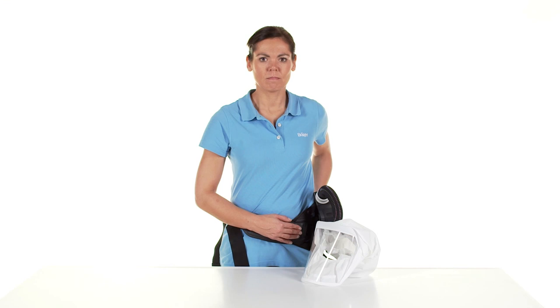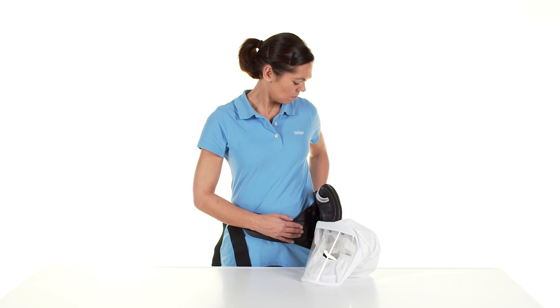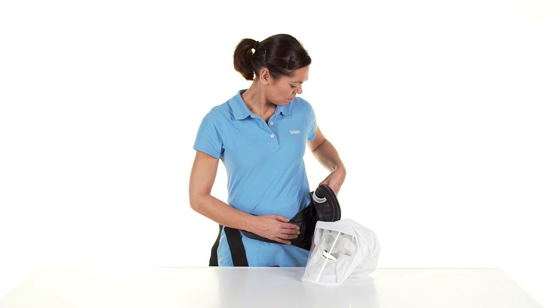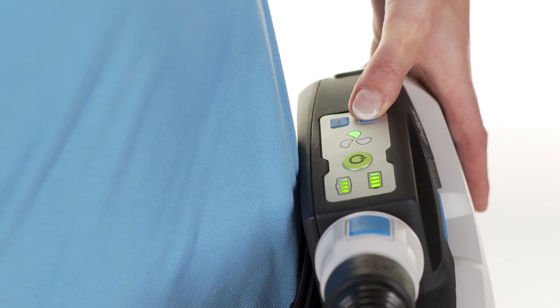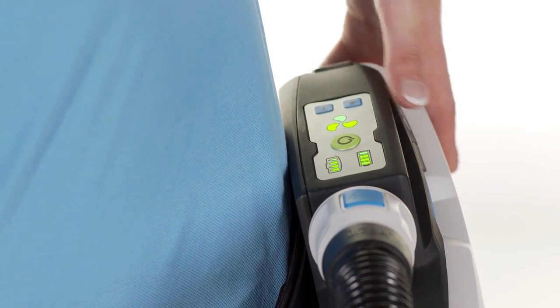The unit automatically detects which headpiece is connected and sets the lowest possible volume flow for that headpiece. You can also adjust the volume flow yourself using the plus and minus keys on the control panel. There are three flow levels.